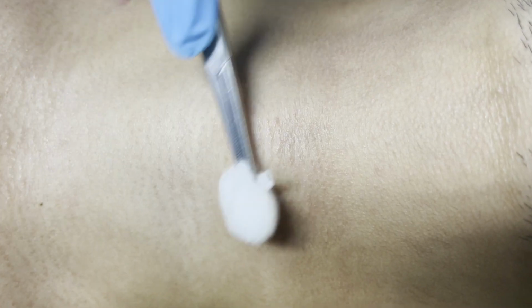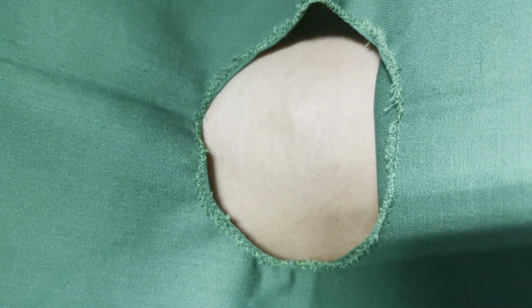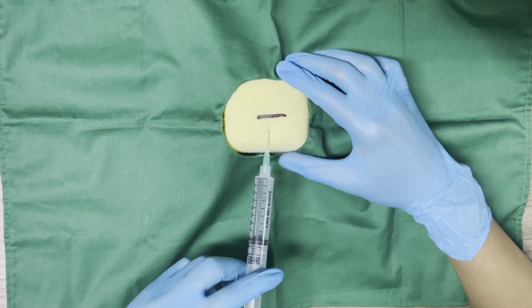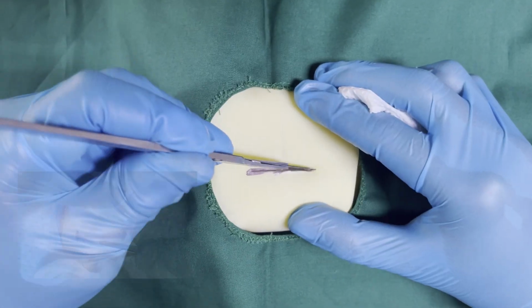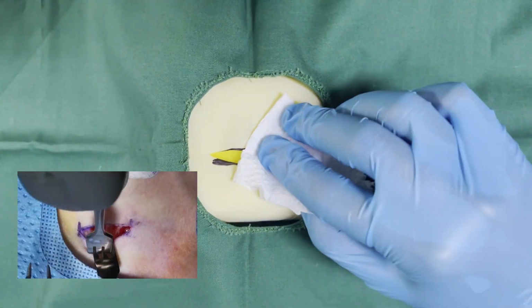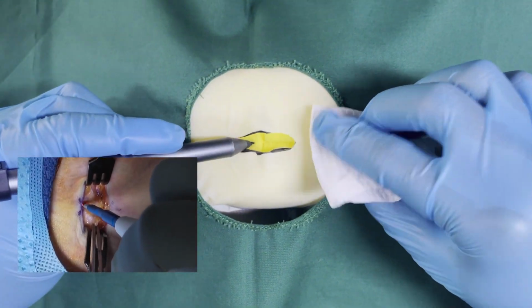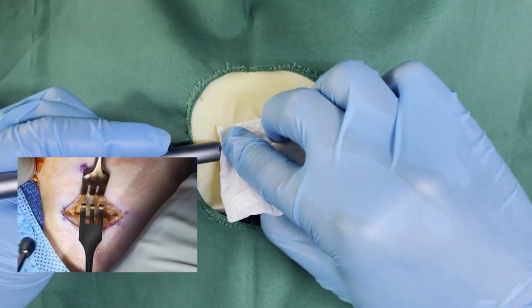Prepare the site by sterilizing the skin of the anterior neck and chest and then drape the neck. Infiltrate the skin with a local anesthetic such as lidocaine. Make a horizontal incision along the marked area through the dermis. The subcutaneous tissue is then dissected by an electrocautery to aid in exposure and to prevent later fat necrosis.